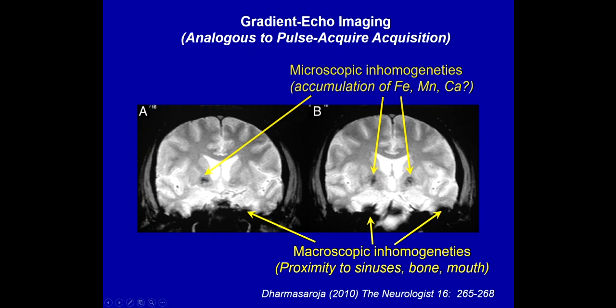That means the T2 star effects go away a bit, and you get a very slight signal increase in those regions. T2 star becomes a little longer. It gets a little closer to the natural T2 of the tissue surrounding the blood vessel. And when I say slight, I'm talking 0.5% or 2%, maybe a few percent.